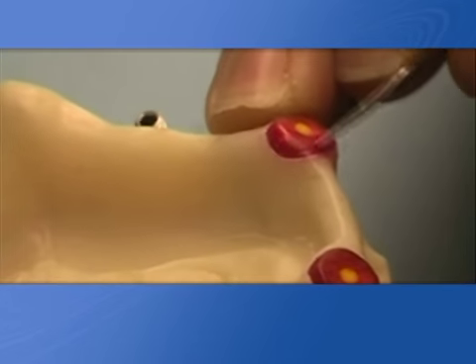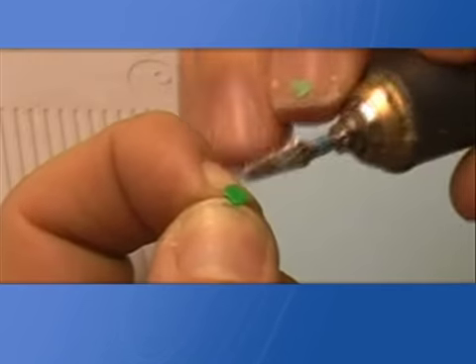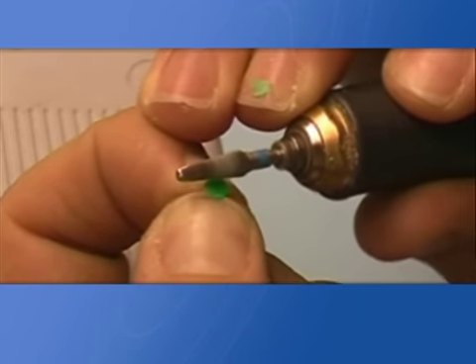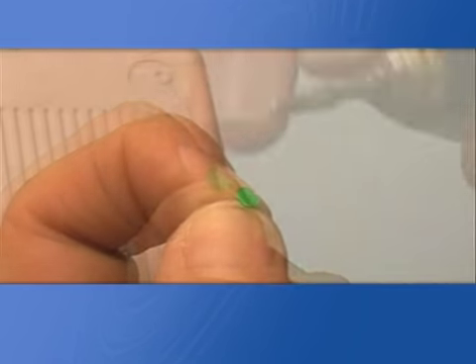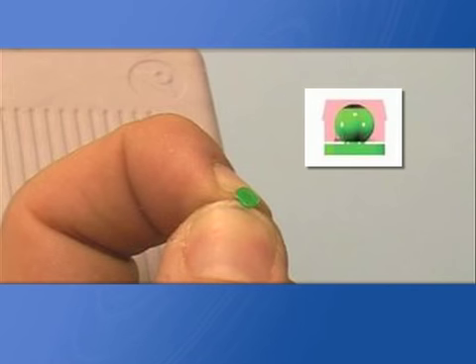Mark the position on the trial mask where the castable sphere will hypothetically fit, using a marker. It is also possible to reduce the thickness of the sphere base, being careful not to compromise its shape, since the space between the retentive cap and the sphere's base is necessary for the correct functionality of the attachment.